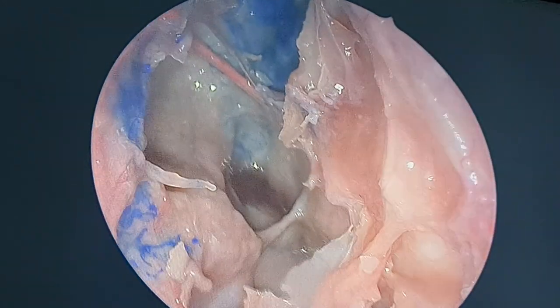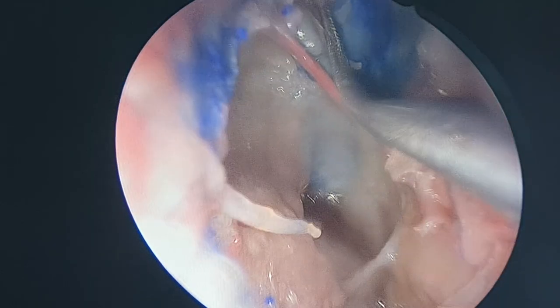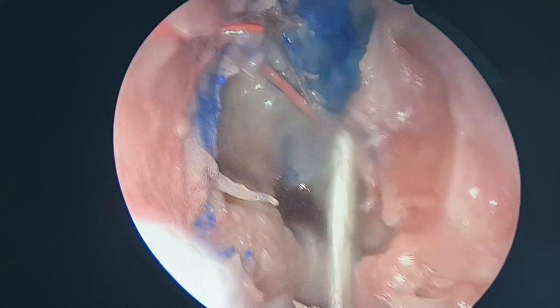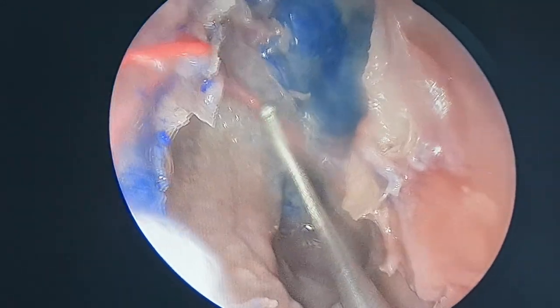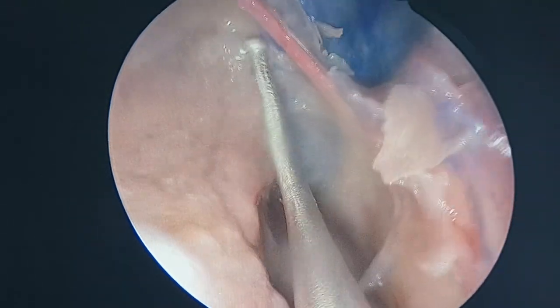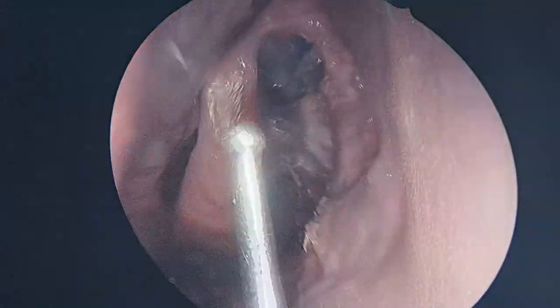How can you define the bulla? So you open the bulla. Once you go behind and fracture, you will see it going right onto the skull base, anterior to the vessel. That's why you do an intact bulla. So once you work keeping the bulla intact, the artery remains behind. This artery is behind the upper attachment of the bulla. That's the most important thing to know.